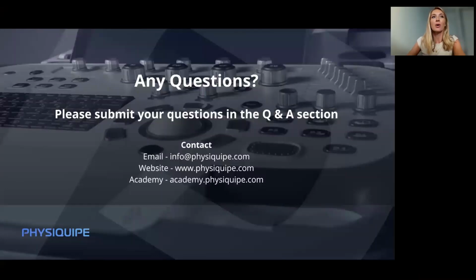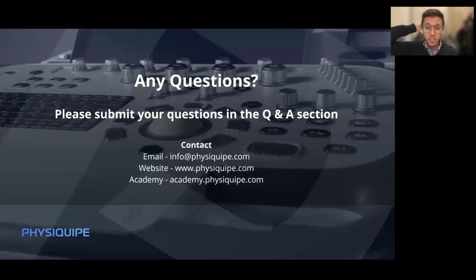So the first question that we have here then was what are the most common chronic injuries and overuse conditions that can be diagnosed using ultrasound? I guess from personal experience would be nice to hear. Yeah, absolutely. So I think the three probably most common joints we scan, shoulders, knees, and ankle are probably the big three really. So tendinopathies, tears, ligament injuries, muscle injuries, that's probably the biggest ones in terms of your chronic issues. Areas are a little bit harder to scan, so the hip slightly less so. There are certain things you can look out for. Spinal definitely really limited when it comes to ultrasound. But yeah, I'd say shoulders, knees, and ankles and tendinopathies really are the big ones.